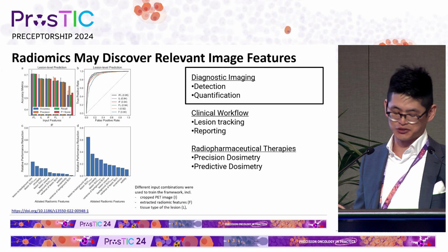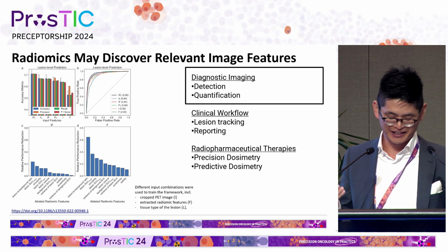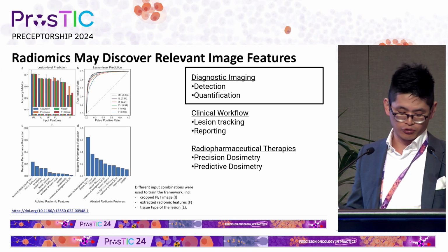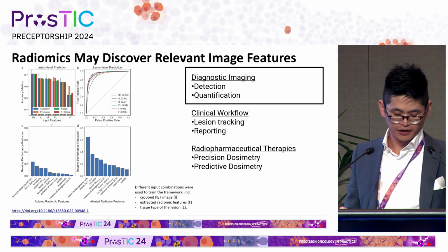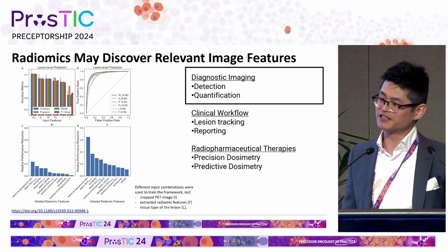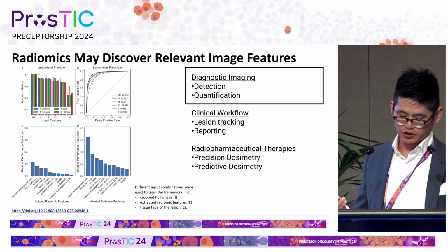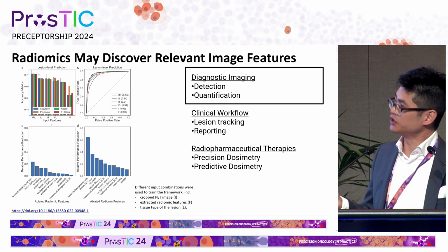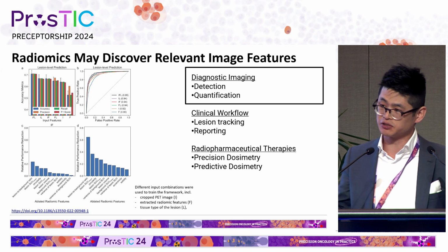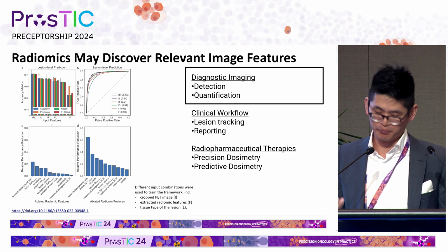However, the challenge is one of statistics. As the saying goes, lies, damn lies, and statistics. And so the challenge is ultimately about external validation of whatever we find. Because if you throw in the kitchen sink, you're going to find something that sticks. In this study, they showed, interestingly, that sphericity, or here they call it circularity, was associated with predicting disease in a PSMA avid lesion, but we already know clinically that tumor grows in balls.